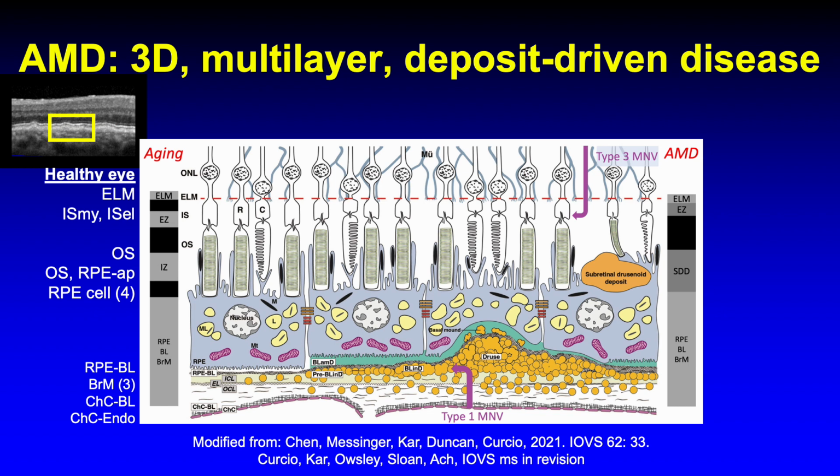To review, the OCTB scan on the left shows the layers affected by AMD. The schematic shows the progression from normal aging on the left to advanced AMD on the right. The reflective bands arise due to the precise horizontal alignment of millions of vertically compartmentalized cells.